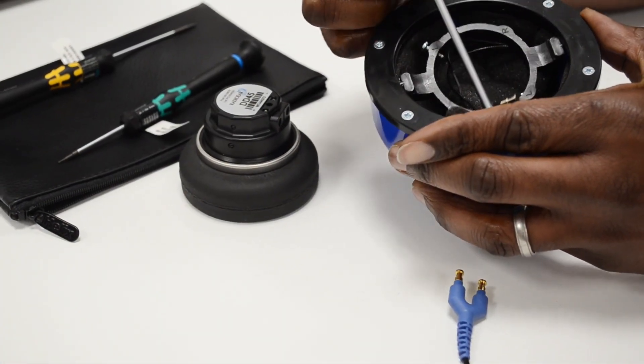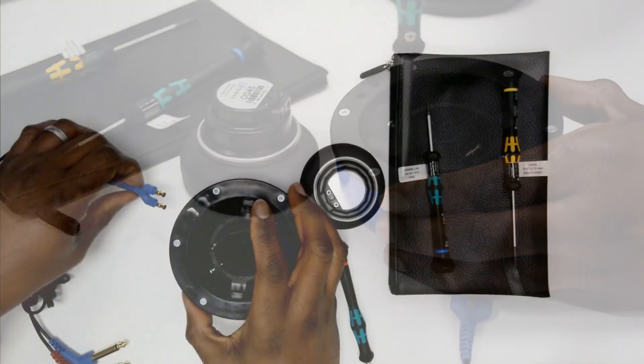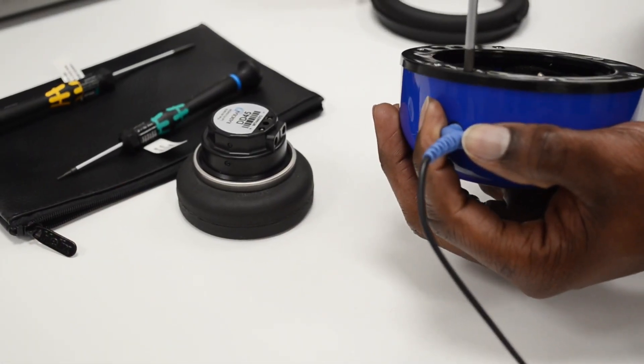If you do this then ensure it's pushed back. Push the earphone lead connector into this connection on the audio cups and tighten the screws so it is fixed.